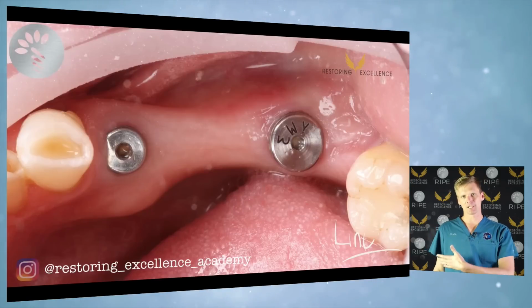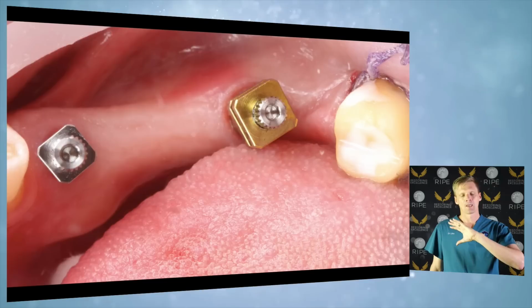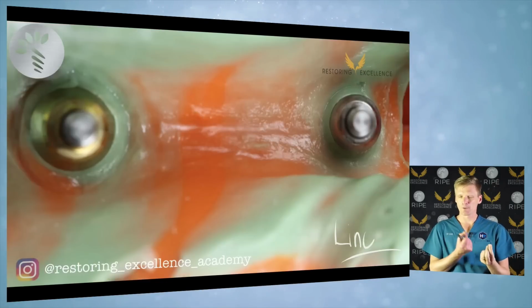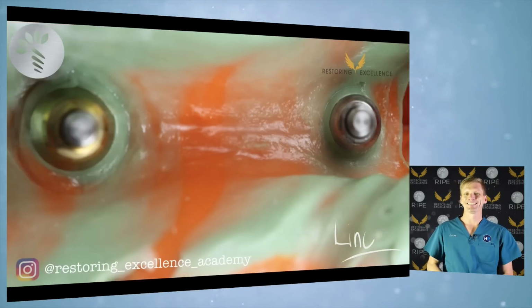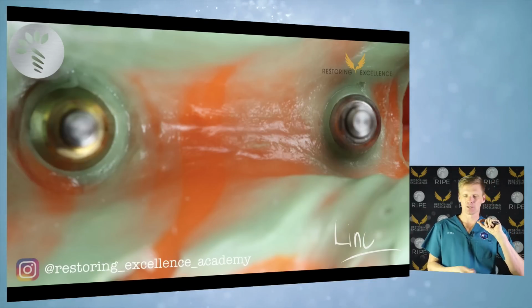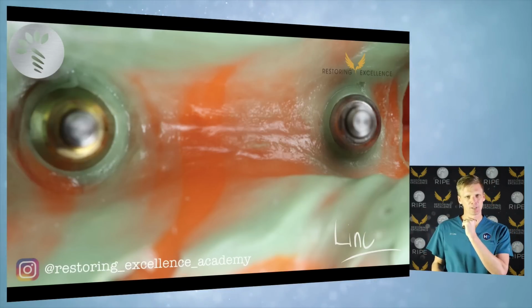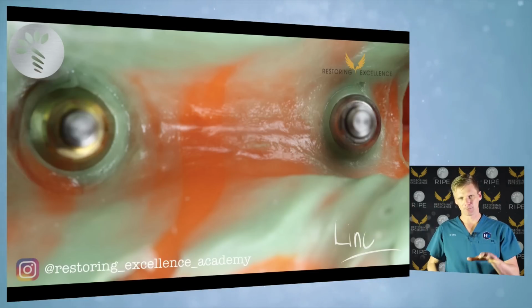In this case, I did that simply by doing an apical reposition flap, and then we come up to the impression. And this impression was so crisp around the implants because there's no movement, we know there's no saliva. We get that by having an Optragate in, and we have one assistant helping us dry the teeth or holding the small suction in, and it comes out just as the light body and the heavy body go into the mouth.